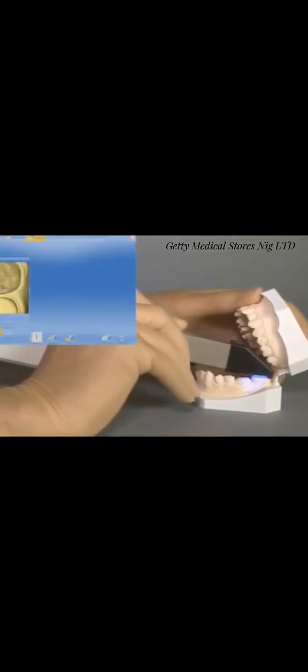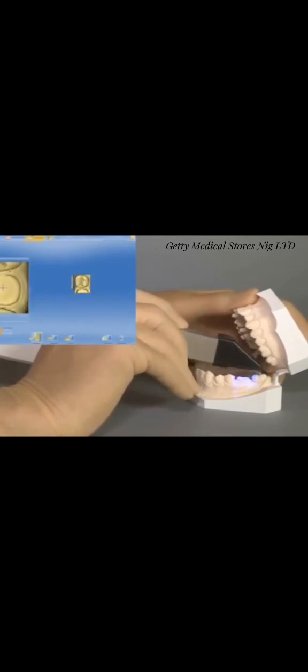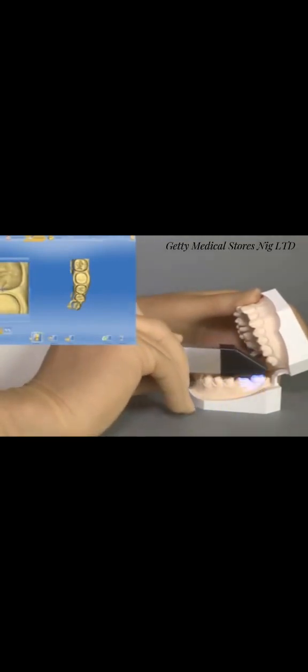We commence scanning from distal on tooth 3/7 with overlapping scans forward to mesial. In the premolar area, we tilt the camera slightly buccal-caudal to ensure we capture sufficient buccal facial surface for buccal bite registration. We scan the proximal contacts of the neighboring teeth so that any undercuts are also shown. This facilitates a better design of the interproximal area. We now check the model.